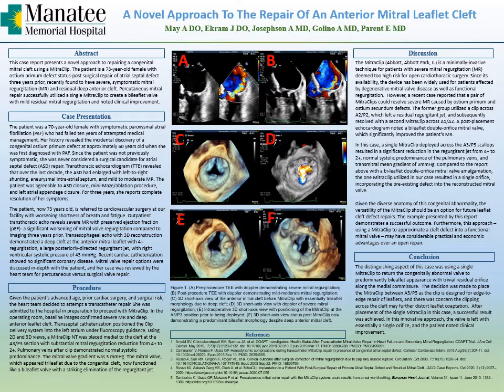The advantage of using the MitraClip is not having to open the chest wall and accessing the vein through a small cut, which means decreased wound infections, blood transfusions, the use of mechanical ventilation, and decreased length of stay. Length of stay is typically overnight, with the patient getting to go home the following day as opposed to a facility, as was the case with our patient who was eager to get back to her active lifestyle.